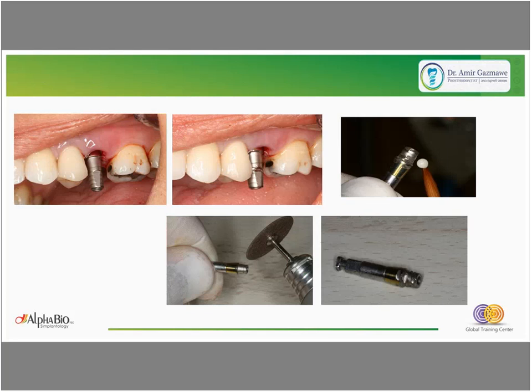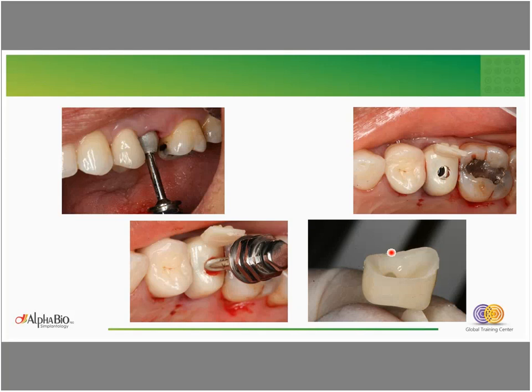The temporary restoration can actually be done chairside in the mouth using an abutment. We can use a regular abutment with cut height, and we can adjust the excessive height of the abutment extraorally, then make some retentions on the abutment, and connect the abutment back. We take a pre-customized crown, make a small hole, and rely this crown on the abutment, and that's the way that we can convert the abutment to a screw-retained abutment.